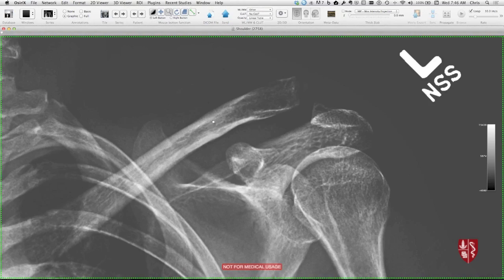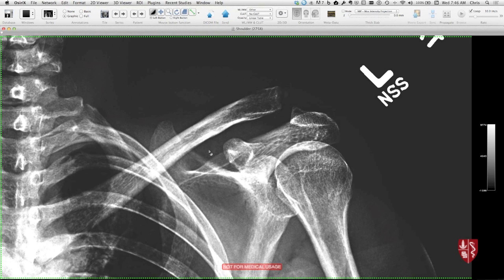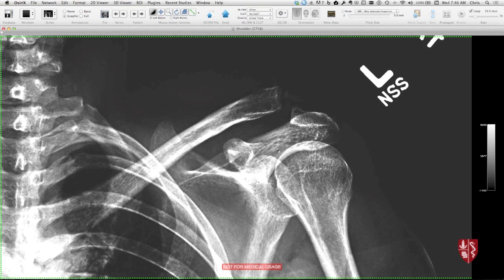Next case here — I'll show the frontal view first. What do you think about the alignment of the AC joint in this patient? Yeah, it's widened, it's a little bit widened here, and it's also malaligned in that — remember — the undersurface of the distal clavicle should line up with the undersurface of the acromion. So this elevation of the clavicle is abnormal. That's consistent with an AC joint sprain of probably a mild degree, because the distance between the coracoid and the clavicle is still normal. One thing that's tricky on these shoulders is the coracoid itself — when I show you the oblique view, you'll see what I'm talking about.